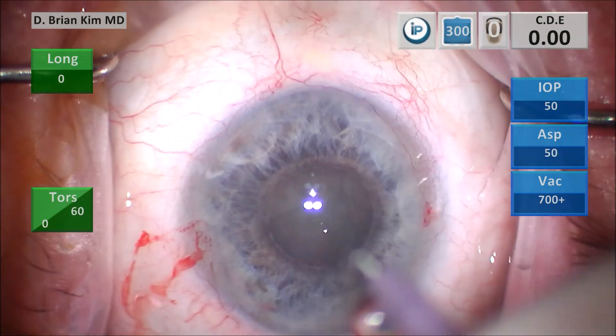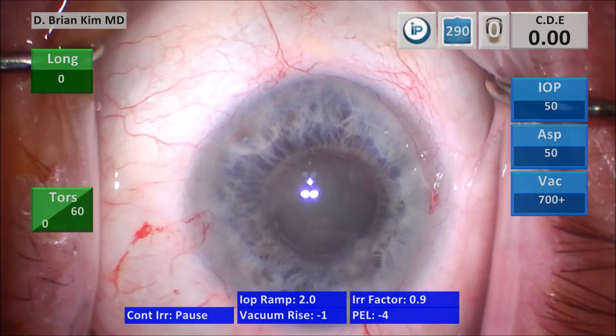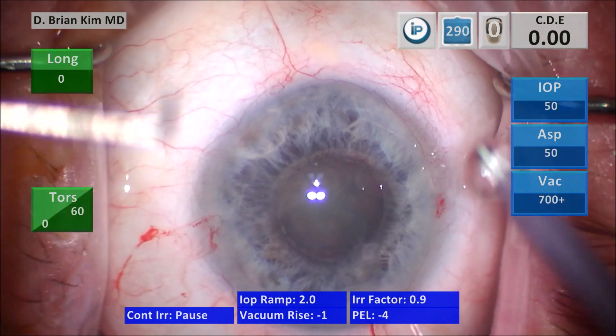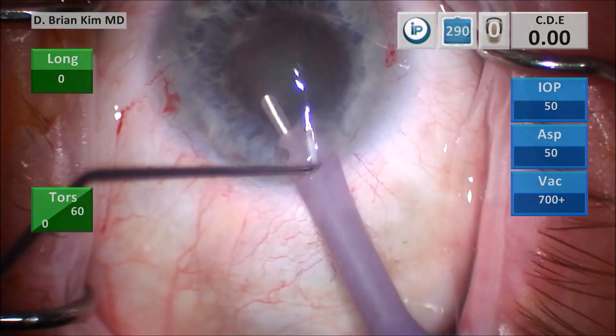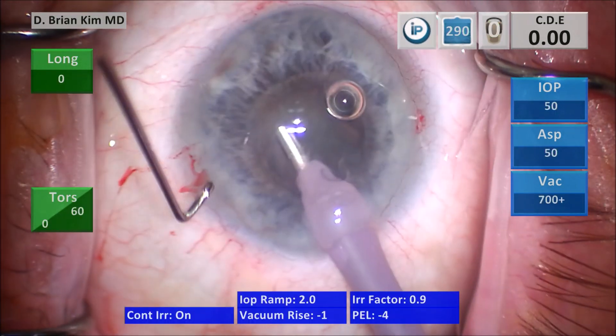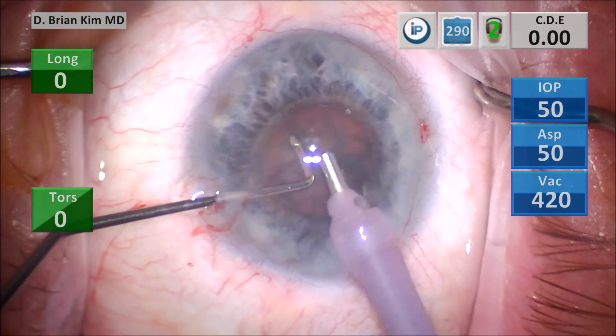I'm irrigating the surface of the cornea, turning the sleeve to make it the right size for the chop technique. Lift the incision with the chopper, go in with irrigation off to minimize Descemet's trauma. I'm going to remove the surface epinuclear material and then begin the double chop.